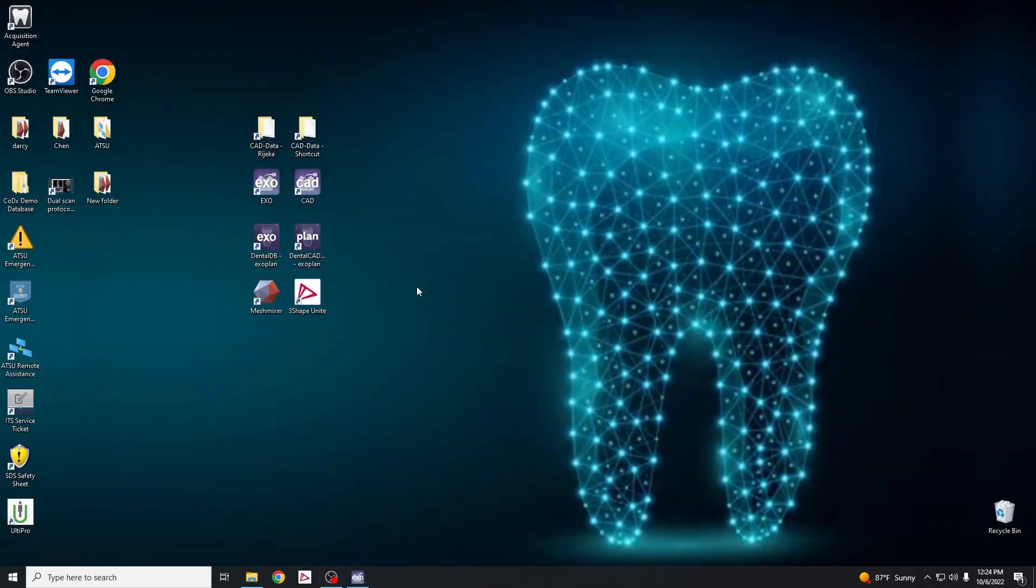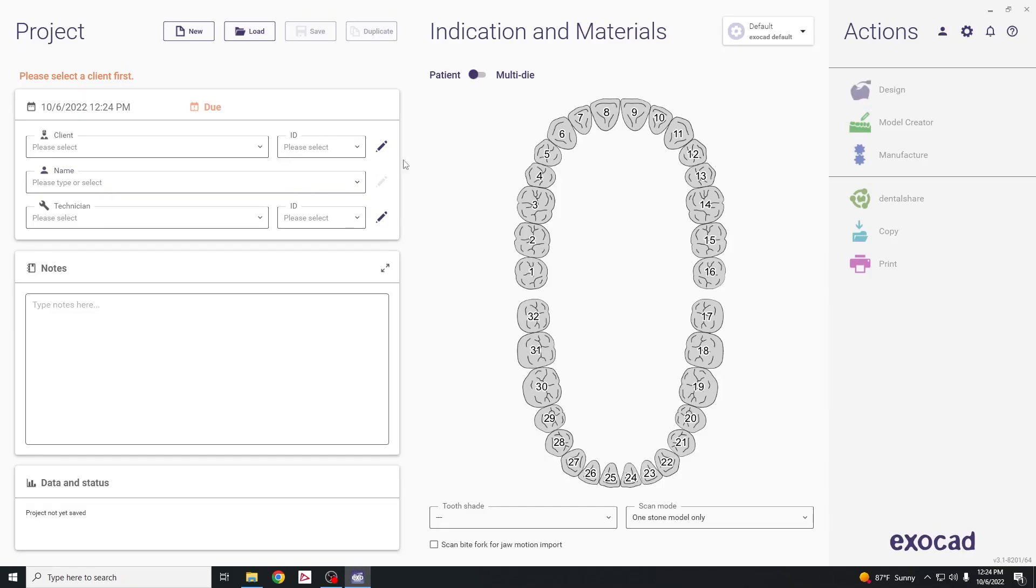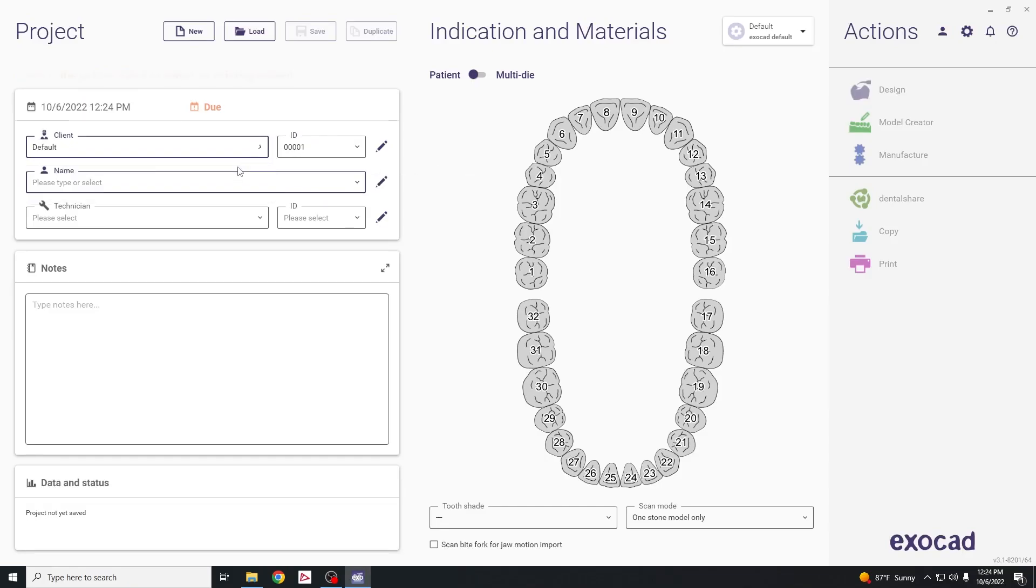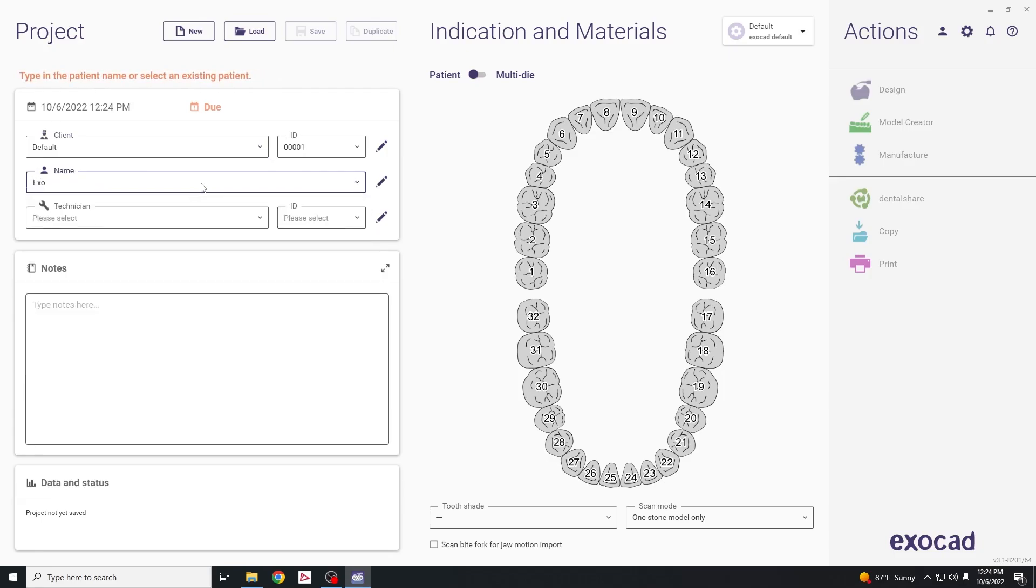The next step is to launch the Exocad software. Start with the one labeled EXO and double click. For client, choose default and then enter the patient's name.